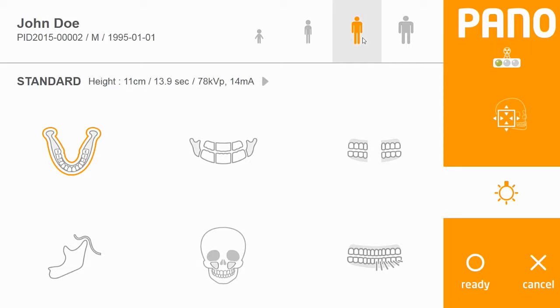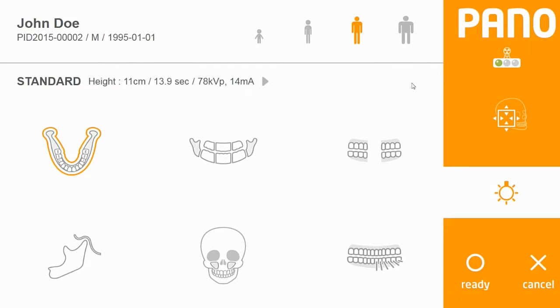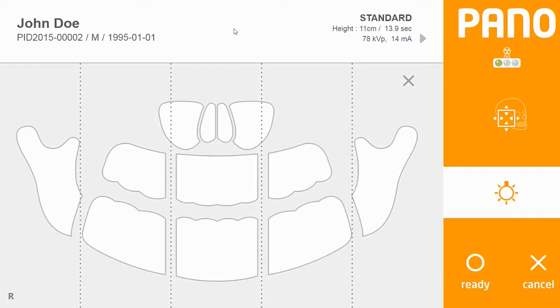If the preset sizes are not adequate, you can change them using manual adjustments with KV and milliamp settings. The middle section of the window is protocol options. The default is the standard panoramic option, and this video will take you through taking an optimum panoramic image. The option to the right gives segmented panoramic images. By clicking the icon, you can select or deselect the areas to actually acquire the image.